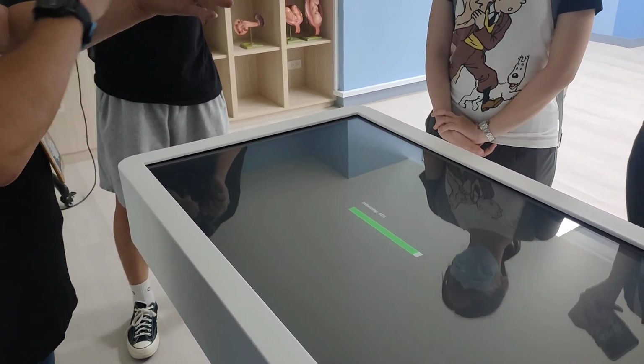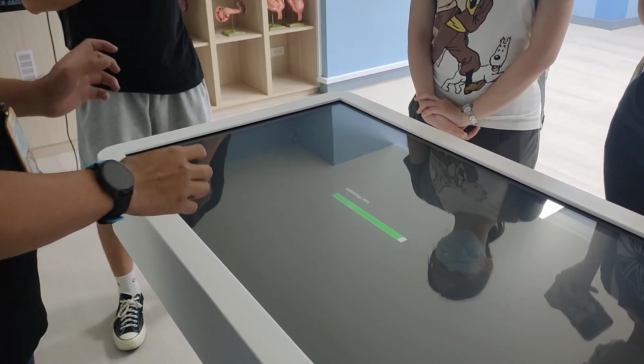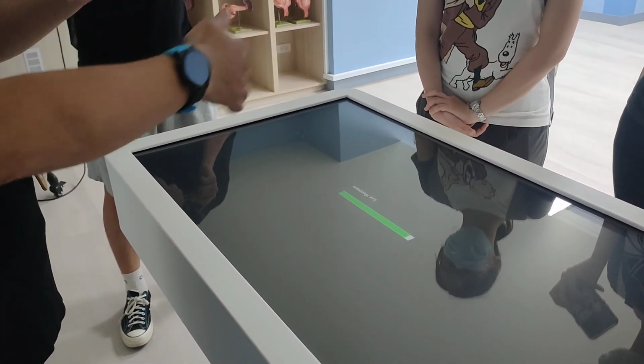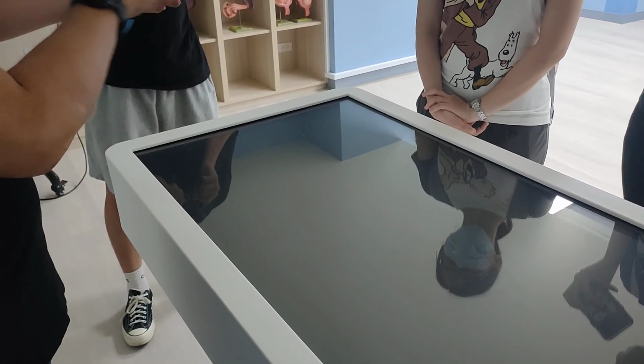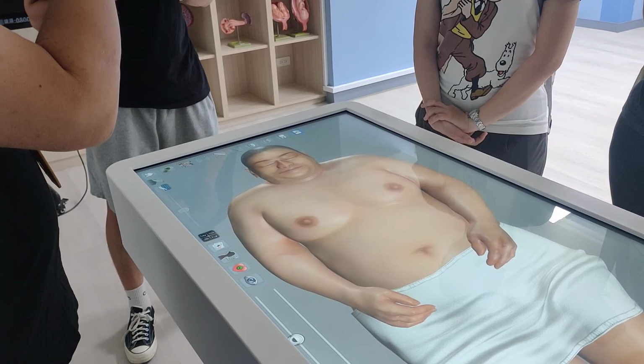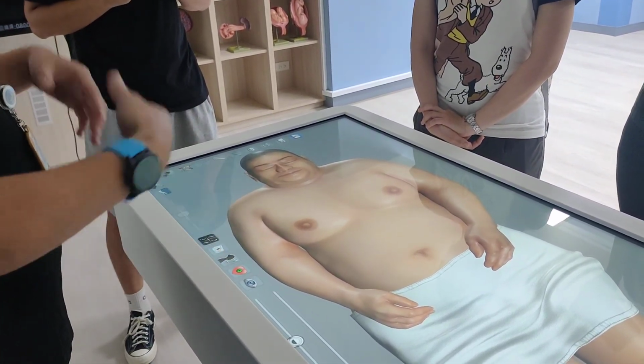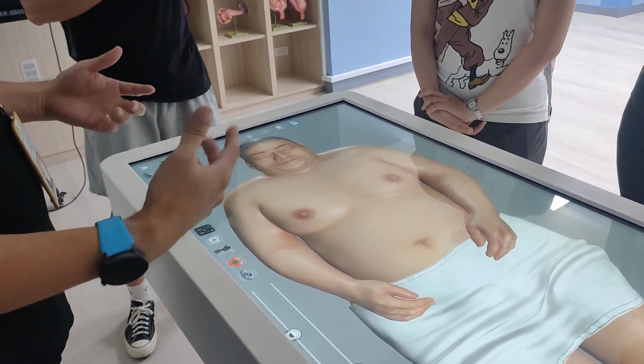Then after planning, you can come here to take the image or take the video and go back and assemble them together. And after getting all of the data, then you can see, figure 4 is not clear, and I want to take again, and you can come back and take the figure or take the video again.